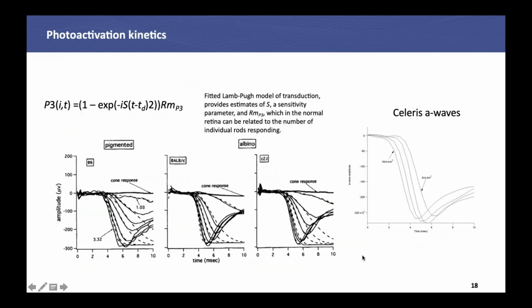What we also intend to do, and this follows some work that we did a long time ago, is look at the phototransduction cascade in these animals to see whether there's something going on at the different steps. What we're showing here are the A waves to very high intensities, much higher than what I showed you for our standard testing protocol.